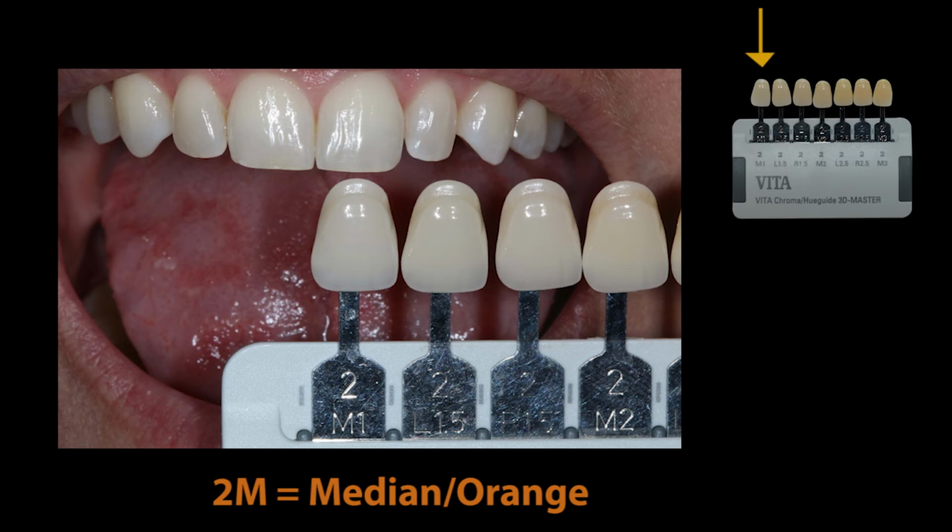As you noticed, I held a 2M1 in reference to the natural tooth. And we know that the M is an orange hue. So my question to you is, what do you see in that shade tab in reference to the natural tooth? Does it look pretty good? Not too bad. Hard to pick it apart.